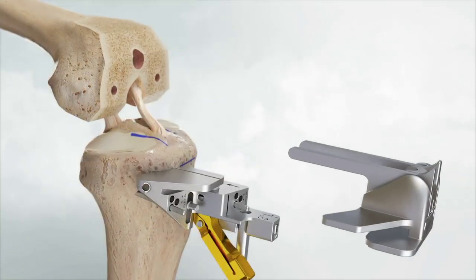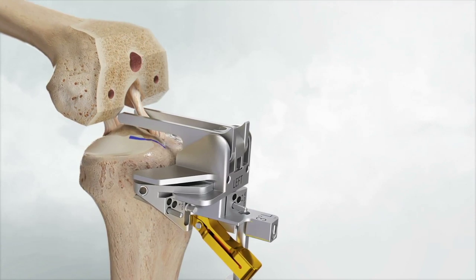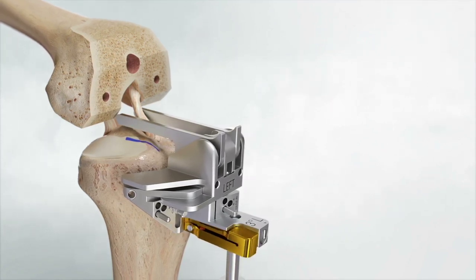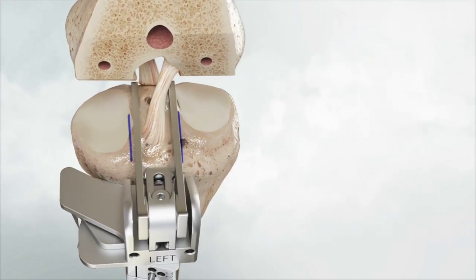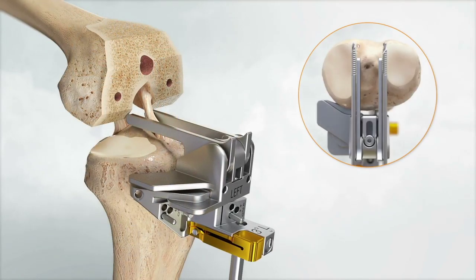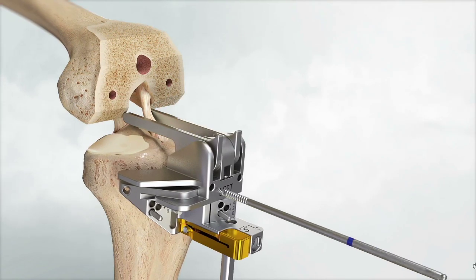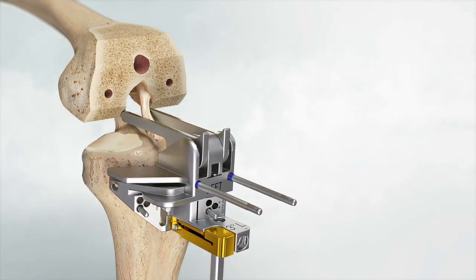In flexion, assemble the orientation stylus by engaging the foot into the tibia datum block and ensure the arms line up with the provisional eminence marks. Lock the orientation stylus by pushing up on the gold locking cam. Verify that the cruciates are inside the resection planes, indicated by the outer surface of the orientation stylus arms. Before locking the orientation stylus into place, check with an Angel Wing to ensure the cutting plane lines up with the previous tibia markings. After the gold lever is used to lock the orientation stylus into place, drive a 1/8-inch drill or 3.2 by 110 mm pin into each of the medial and lateral undercut protection holes. Be careful not to protrude through the posterior cortical bone.